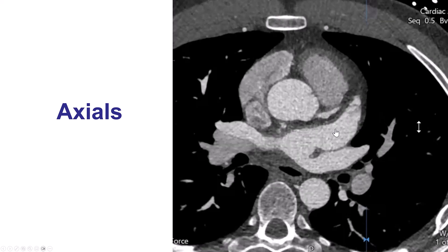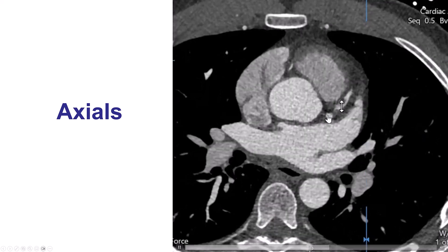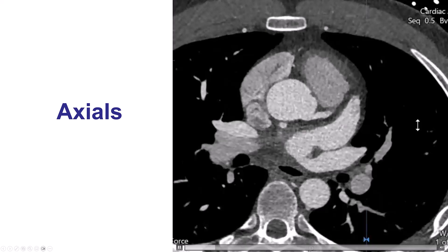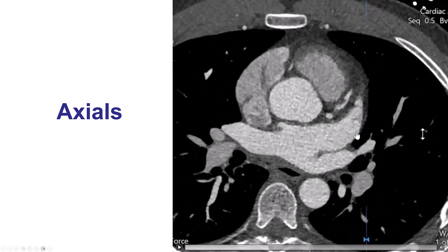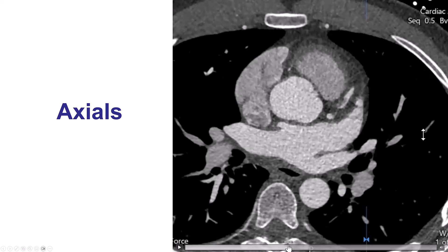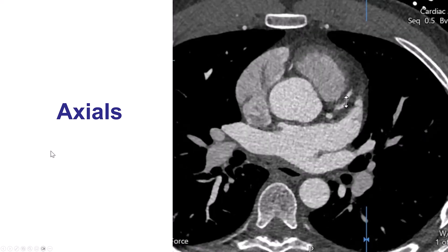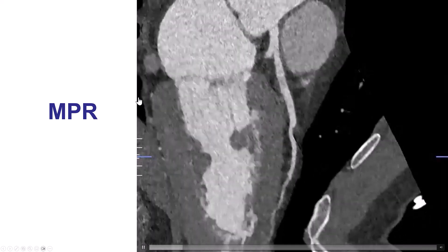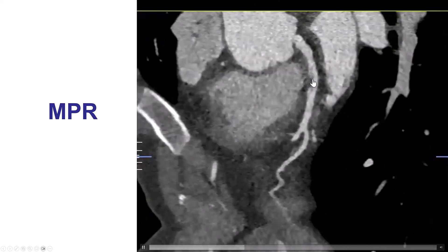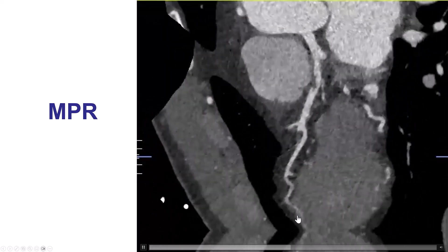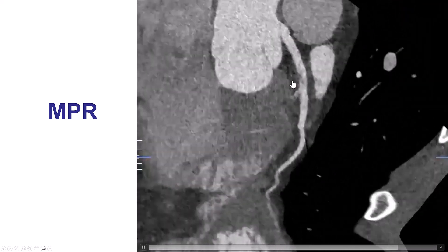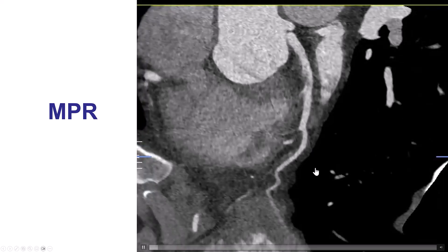This is the axial view, in which we see the left main going into the LAD, and we do see this filling defect into the LAD. This is essentially a filling defect within the LAD — we don't see any significant atherosclerosis in the remaining vessel. These are the multi-planar reconstructions, or MPRs, essentially a way to rotate the artery that has been reconstructed. We can again see at various rotations that there is this area of filling defect within the proximal left anterior descending artery, with no significant disease elsewhere in the artery.